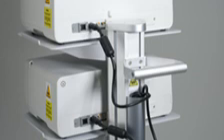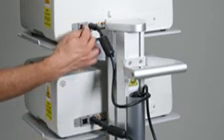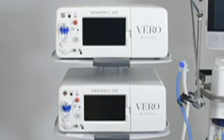Ensure the power cord is firmly seated in the power supply and connected on the back of each console. Ensure the black rocker power switch is pushed down towards the power connector. Press the silver power buttons on both consoles. The display screens will illuminate and the consoles will beep, indicating the power is on.